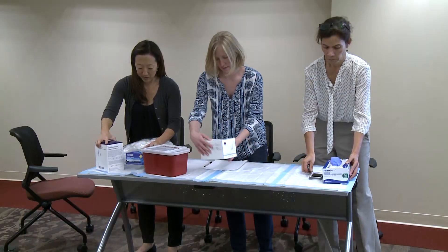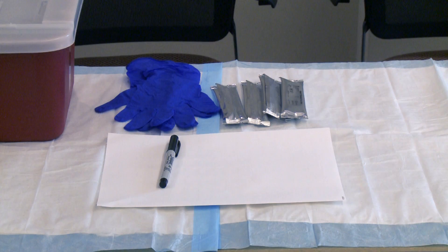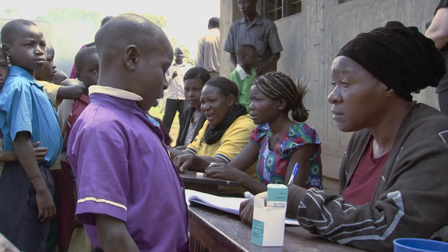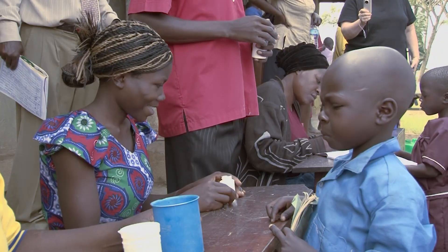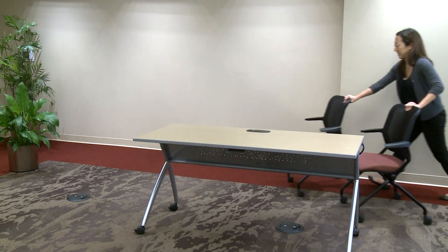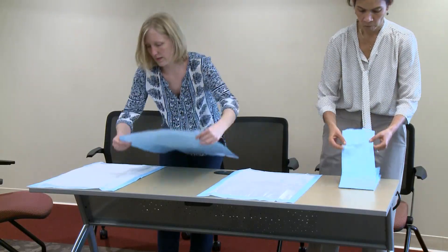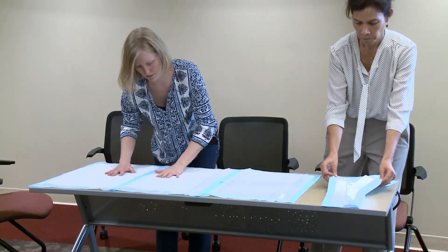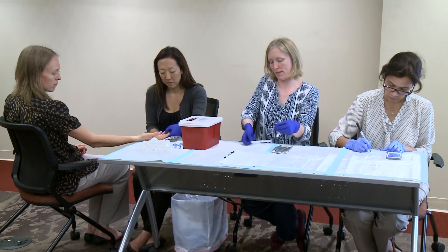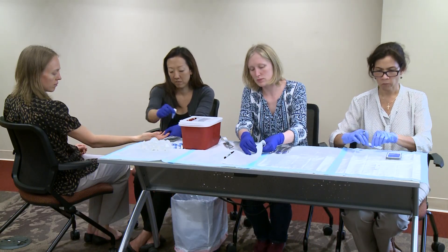It is important to set up and organize the blood collection and FTS processing stations before the first blood sample is collected. A flat work surface is necessary to ensure the FTS can be conducted properly. Usually, a table and chairs can be provided by the school or community where the survey is being conducted. The workstation should be covered with absorbent underpads. In many cases, different team members will be responsible for blood collection, labeling and processing FTS, and reading test results.